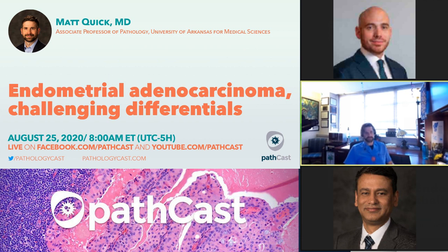And unfortunately, that's the case. But I think there are ways that you can get around it, especially if we use the TCGA data. We know that grade 3 endometrioids have more PTEN loss. Serous almost never has PTEN loss. So I like to use PTEN in that scenario.